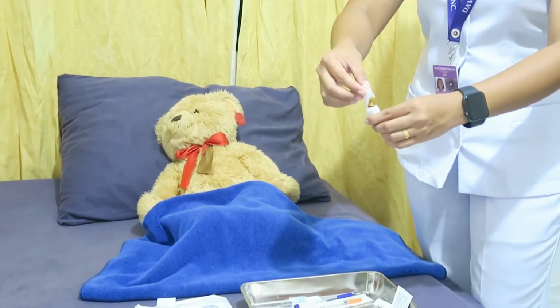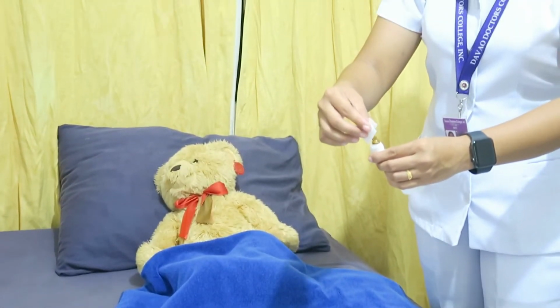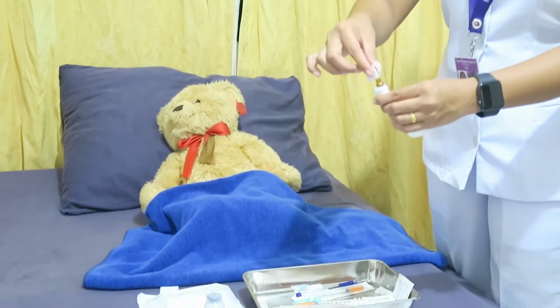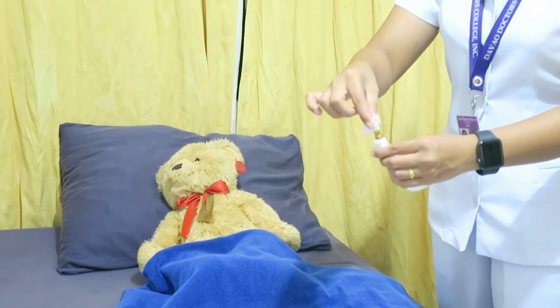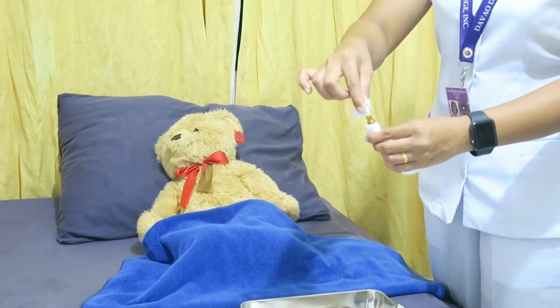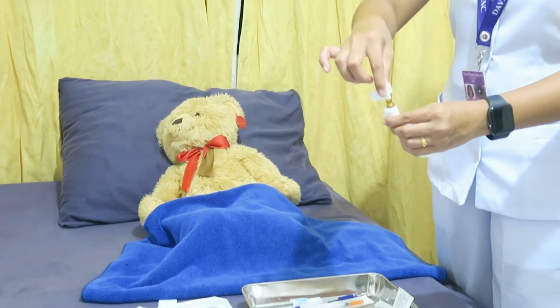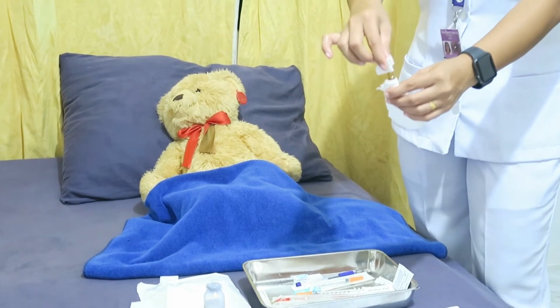Then use an ampule opener, or place a piece of sterile gauze or alcohol wipe between your thumb and the ampule neck, or around the ampule neck, and break off the top by bending it toward you to ensure that the ampule is broken away from yourself and away from the others.